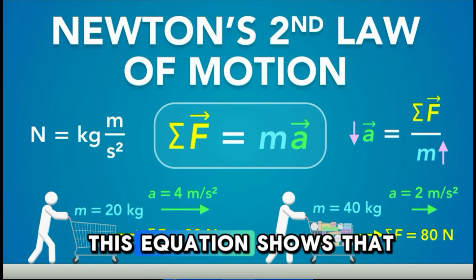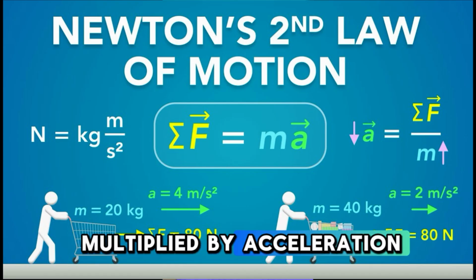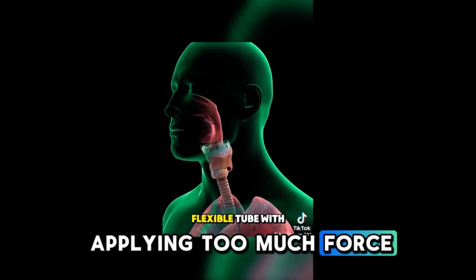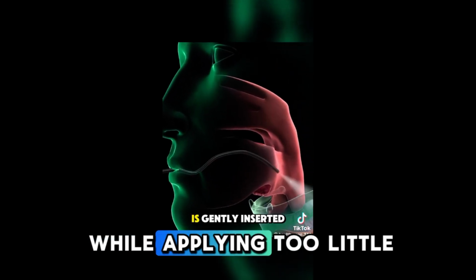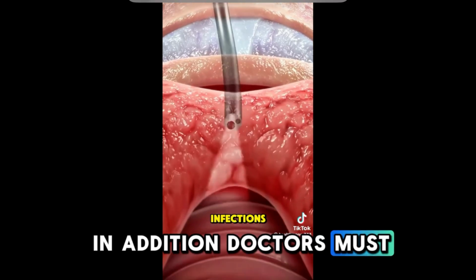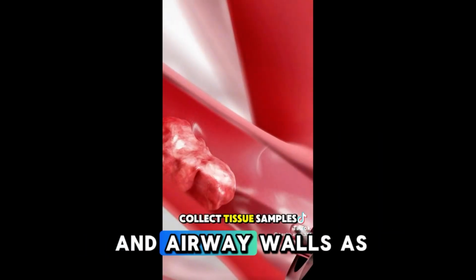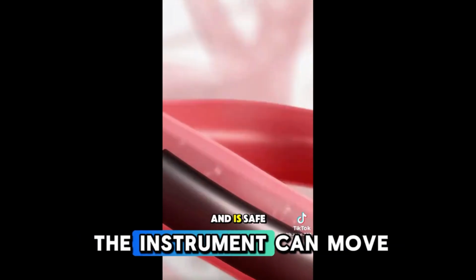This equation shows that force is equal to mass multiplied by acceleration. In bronchoscopy, applying too much force can injure the delicate airway tissues, while applying too little force makes it difficult to move the scope forward. In addition, doctors must consider friction between the bronchoscope and airway walls, as this affects how smoothly the instrument can move.